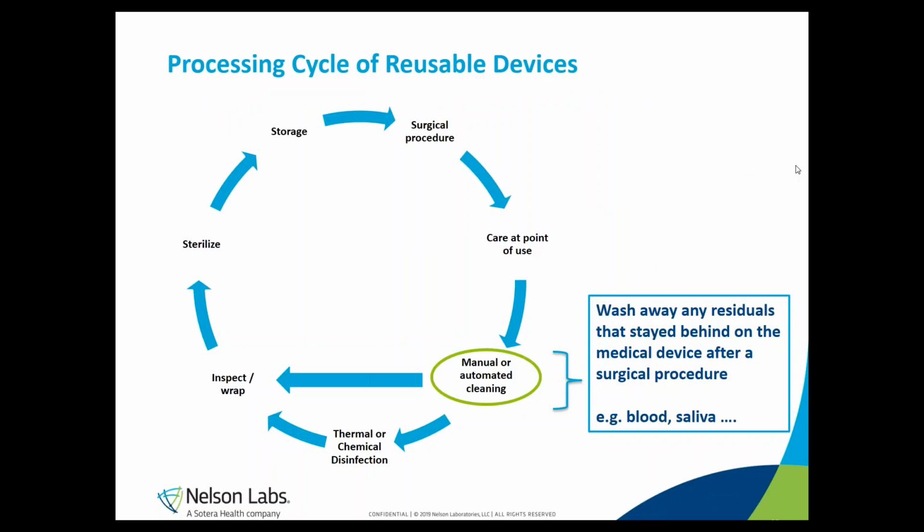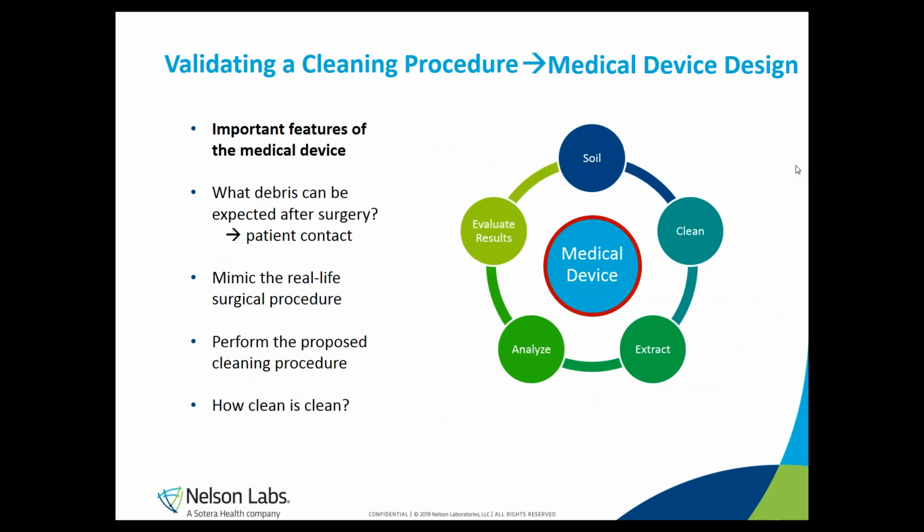It is first of all important to understand what is meant with the cleaning procedure, either a manual or an automated one. Cleaning procedures are designed to wash away any debris that comes from a patient and stays behind on the device or instrument during a surgical procedure. This can be, for example, tissue, blood, saliva, or sweat.